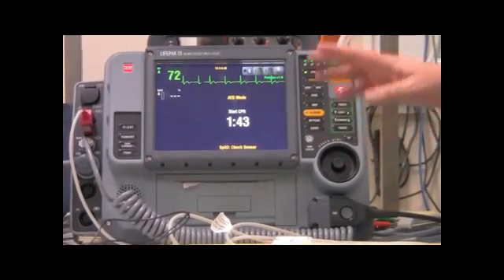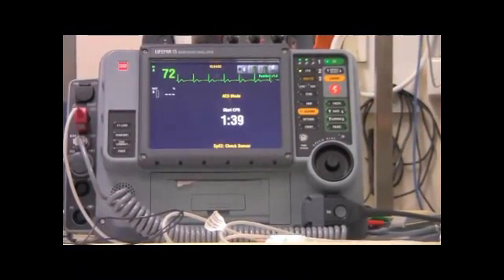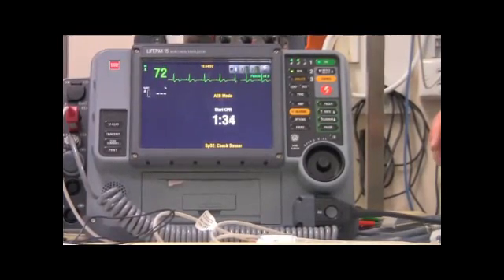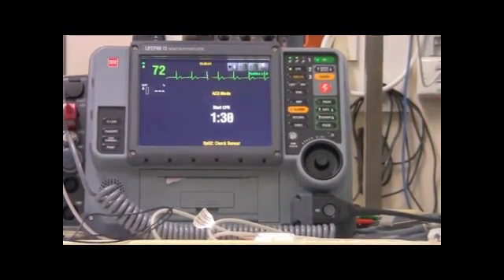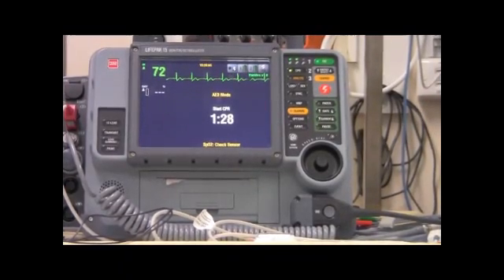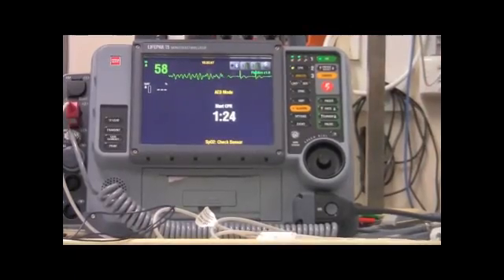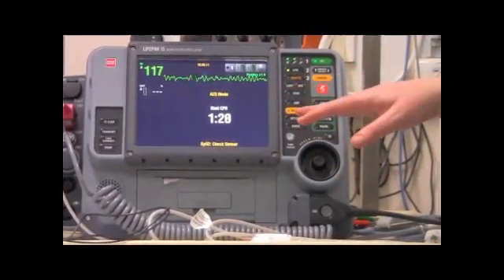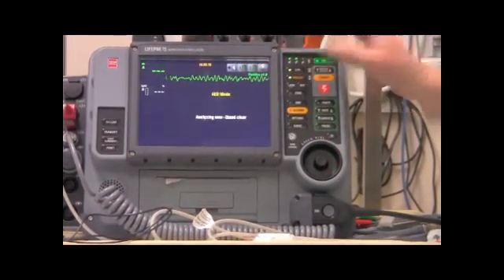So it has a metronome for when you're doing compressions, and it will tell you when to ventilate the patient. Ventilate. So if at any time the rhythm's changed, the machine doesn't actually interpret that rhythm change, but if you notice that there was something different, you could ask the machine to reanalyse.